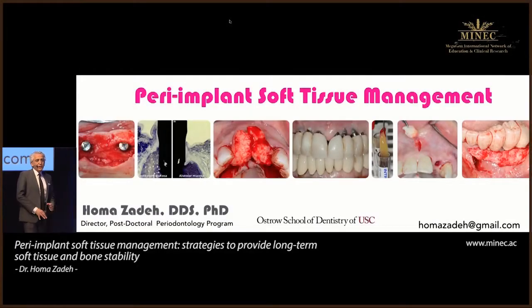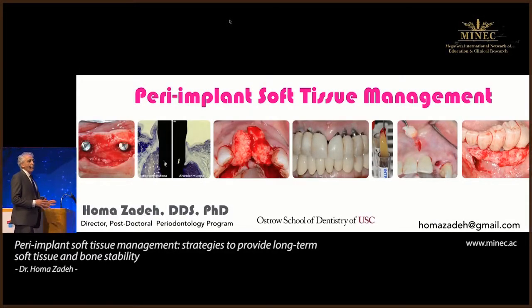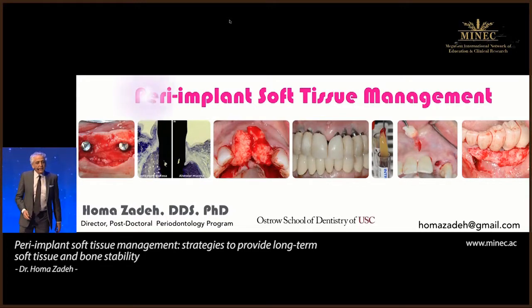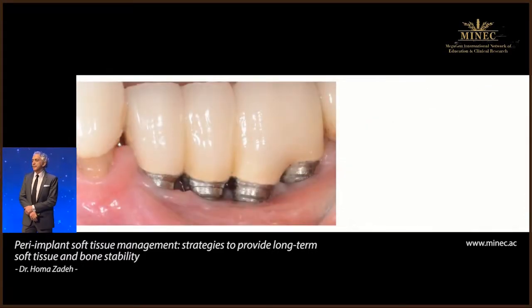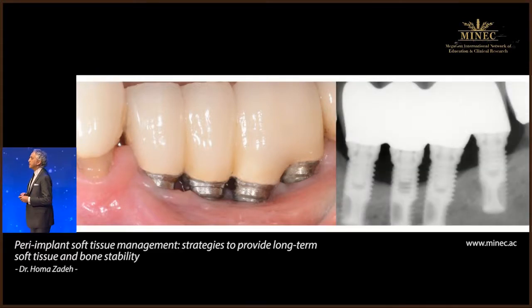So I'd like to talk to you about soft tissue around implants. Many times when we discuss soft tissues, we're talking about aesthetics. But I like to take a little different tack, because we have some cases, not necessarily in the aesthetic zone, where we see soft tissue deficiency. This is one of my cases, maybe for more than 15 years. And then when we look at the bone, we see also marginal bone loss on these cases.